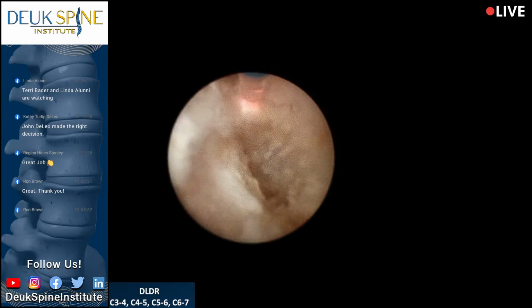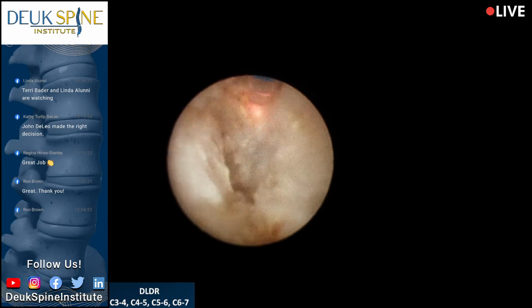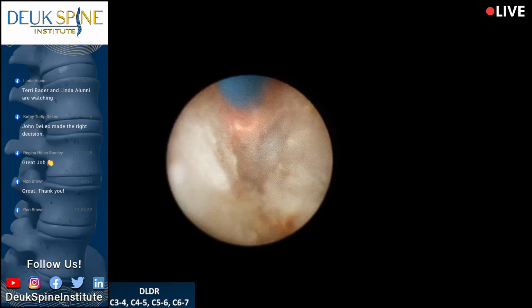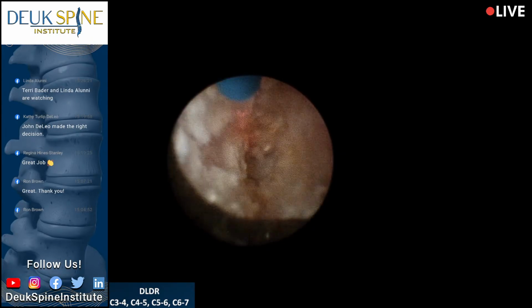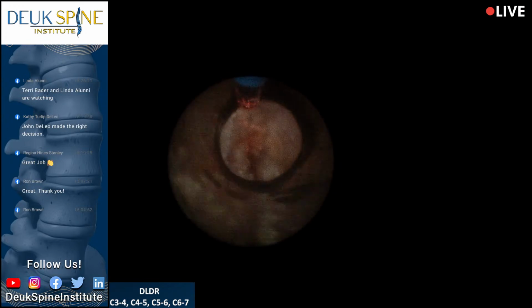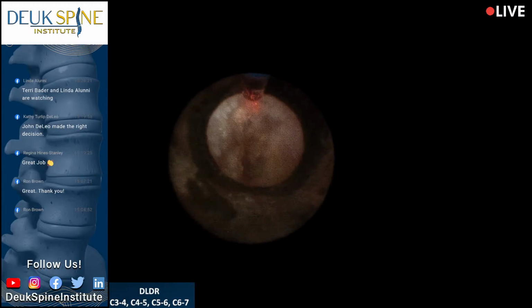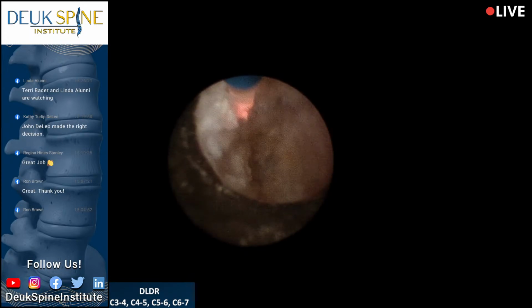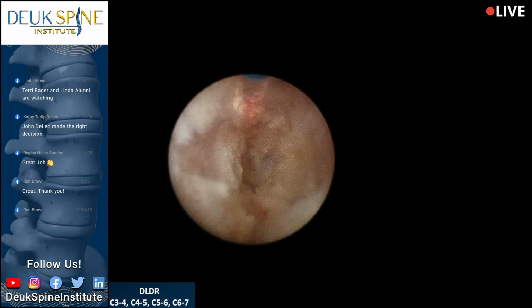The amount of movement we're getting right now is like 1/4 of a degree, and it's more than anything we've had so far, so it's definitely an improvement. You can see the fibers of the posterior ligament down there. I'm really aiming out that foramen with my tube, trying to get as much exposure and visibility of the foramen over there as I can get.